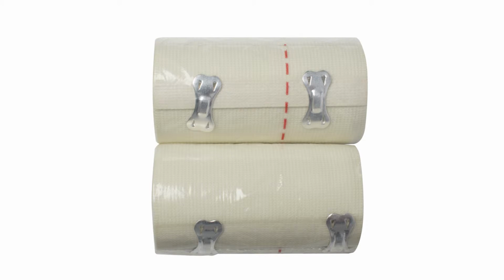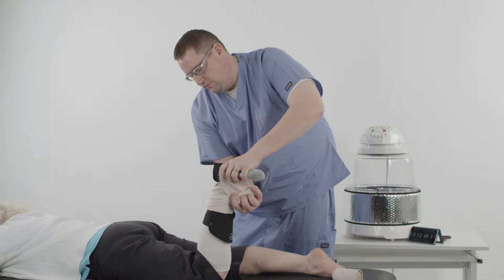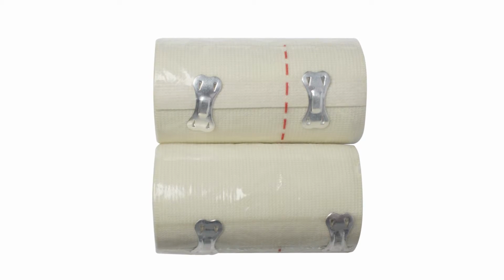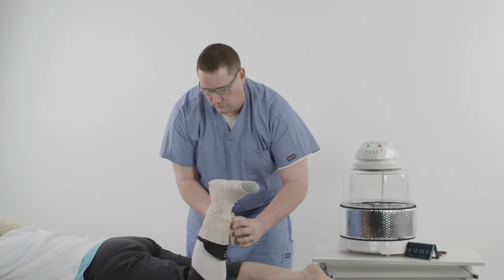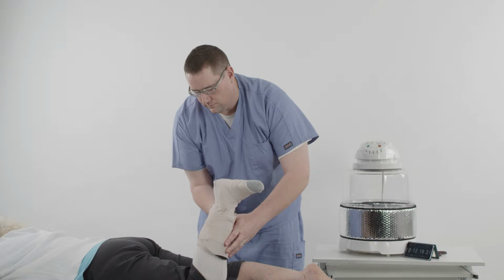Using one of the elastic wraps, securely wrap above the ankle, then under the arch and around the forefoot. Use the second elastic wrap to wrap the tibial cuff. Make sure the entire brace is covered with the elastic wraps.